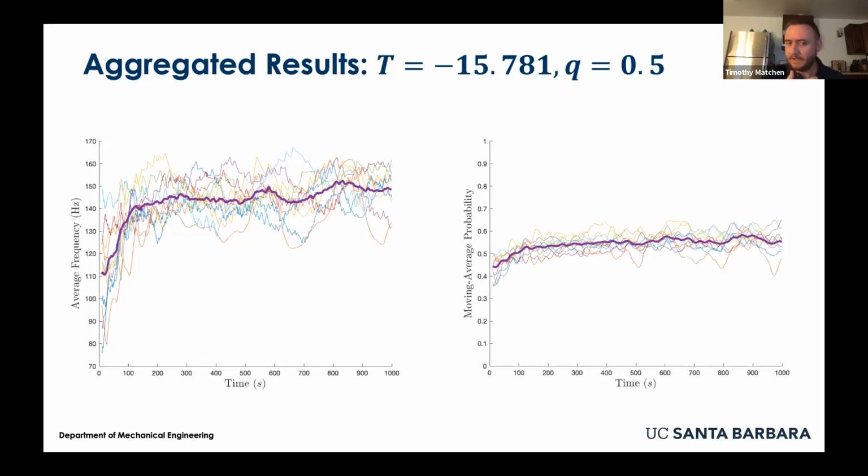But you are going to see more fluctuations because we are trying to keep it a lot more steady. With the conventional deep brain stimulation, you're going to see a lot larger fluctuations in the moving average probability in the figure that you see on the right. I will note it overshoots a little bit in these first 1,000 seconds of simulation. It's around, I think, 0.54 on average in these trials. And obviously, you can see that on a trial-by-trial basis, it fluctuates up and down.